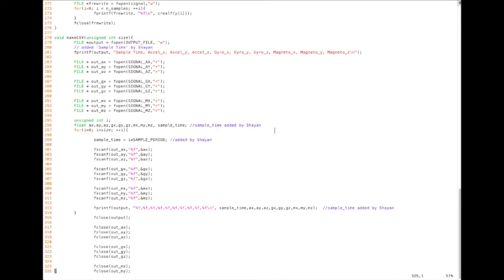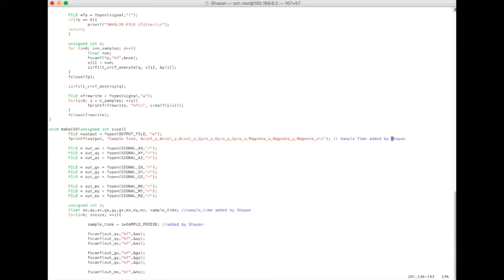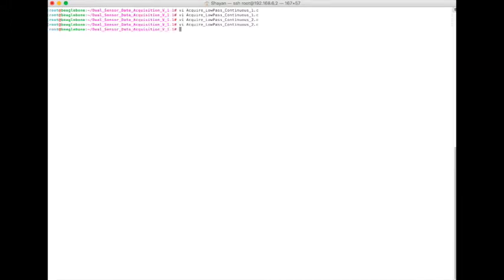We introduced the data structure for the sample time and for the file to print the timestamp to both of them. Please note that the edit on the acquire low-pass continuous file was also done for the continuous 2.c because we're gathering data from two sensors, so sensor 2 also needs to have timestamps printed on its motion data output files. So here's a quick demonstration of the edit on the second C file. And here is the sample time to be printed in the motion data output file. Was done.